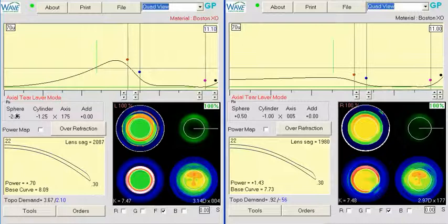This is a more traditional compound myopic astigmat, and the patient still has a residual prescription of minus 50, resulting in 20/40 vision. So in this case, I don't know exactly what the post-wear topographies look like. I think there was a question about the size of the lens also.